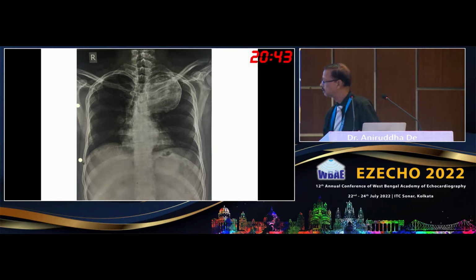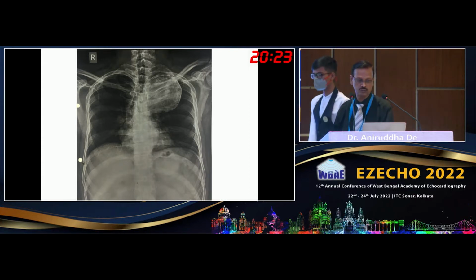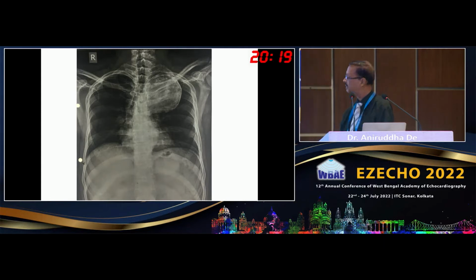A neurogenic tumor. Could be a neurogenic tumor, of course. Any of the panelists? Could we think of pseudoaneurysm of the aorta? Yes, could be, pseudoaneurysm of the aorta. The position is very important, for the aortic valve, calcification actually at the periphery. Is there a linear calcification, sir? Is there a history of trauma in the past? No history of trauma, sir. The patient denied history of trauma.